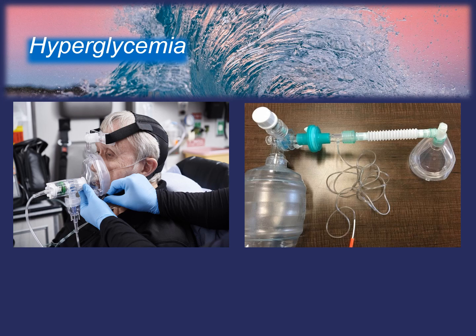We may need to start to see the end-tidal trend upwards on these patients. This is not a good thing. It indicates that the patient is decompensating and you'll have to intervene.